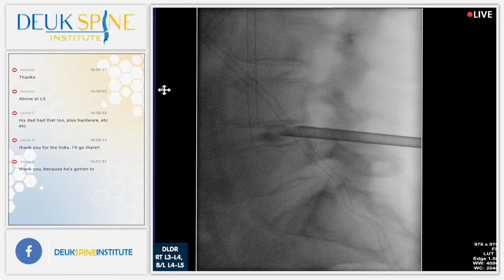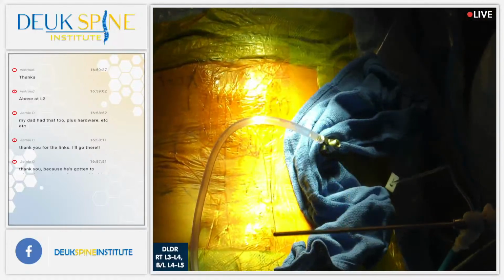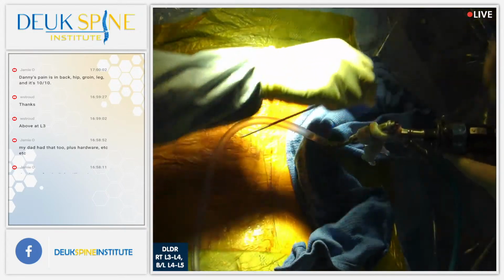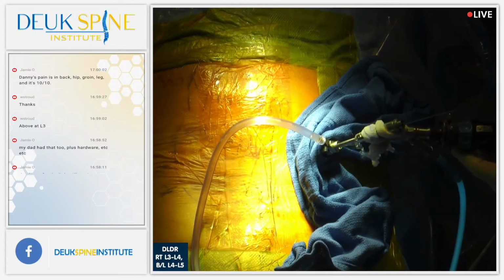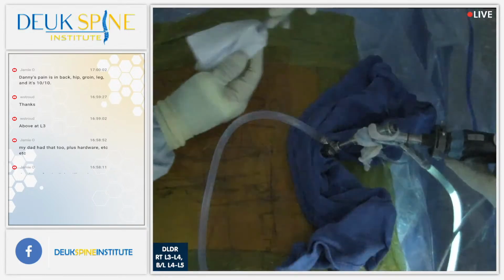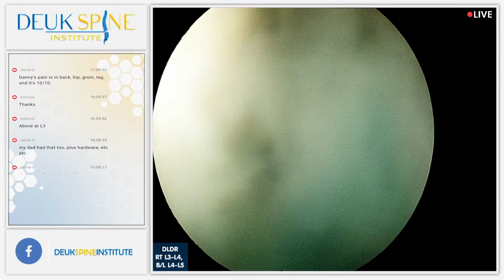I'm Dr. Deuk, the CEO and founder, and this is Luis, if you want to put a staple. Luis is my right-hand man. For those of you who have been coming for a long time, we've been broadcasting these surgeries for 10 years here at Deuk Spine Institute. I need scope on 10 years. And by the way, 10 years ago when we started broadcasting, we were broadcasting fusions, primarily fusions, laser. I did a lot of fusions. We broadcast the entire fusion.